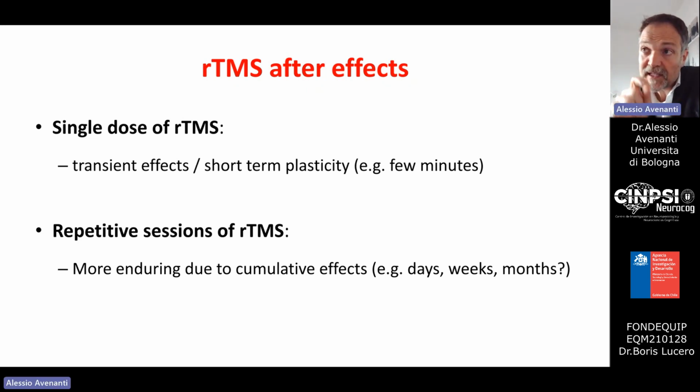Researchers, especially those that started to apply repetitive TMS in several fields, including psychiatry, have started to understand that if you apply repeated sessions of TMS, so you do not provide just a single dose but several doses separated by days, or even more doses in a single day, you can induce long-lasting, more enduring effects lasting for days, weeks, even months. But this depends, of course, on the duration and repetition of the sessions of repetitive TMS.